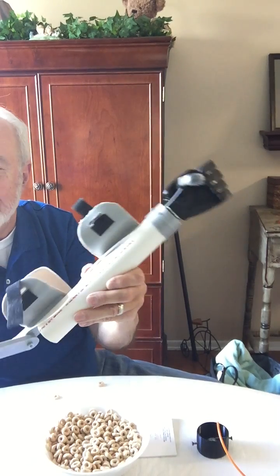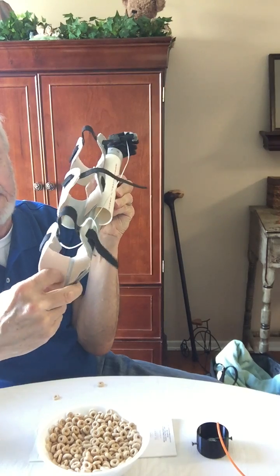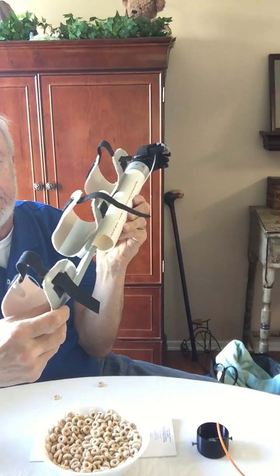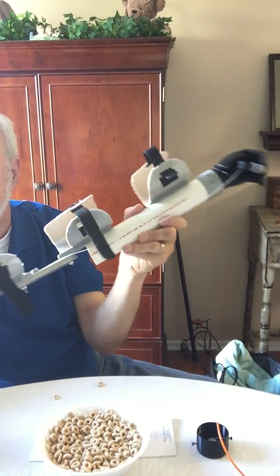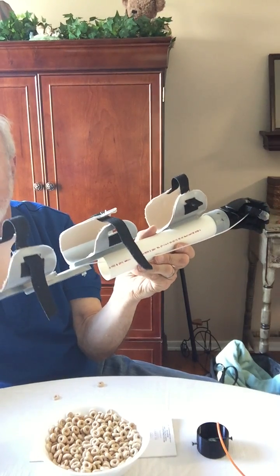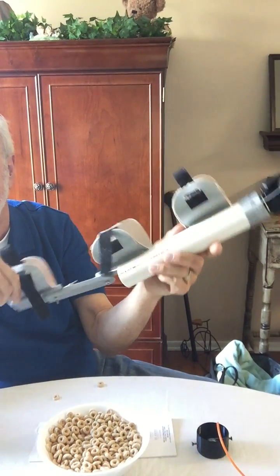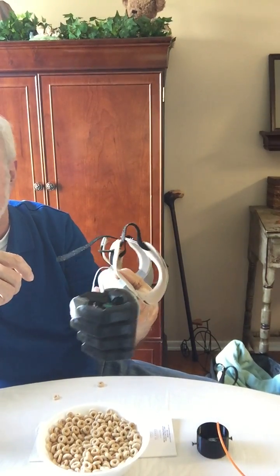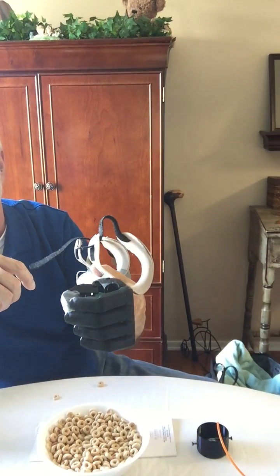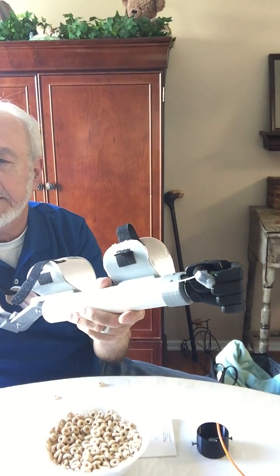So this is a lot easier to fabricate, and we hope it'll be easy to use. You can use a sticky back foam like moleskin, or the foam like we're using on the wrist powered hands, to make it more comfortable. But if just for your own lab testing you want to forego that, it'll give you an appreciation for how it feels to have a prosthesis that doesn't fit properly. The padding is beneficial in terms of your comfort. And using this, you can walk around and see what it's like to have a prosthesis all day. Your arm gets tired pretty quick, and you'll be able to experience what the user experiences. So that's really great for a designer. And that's it for now.